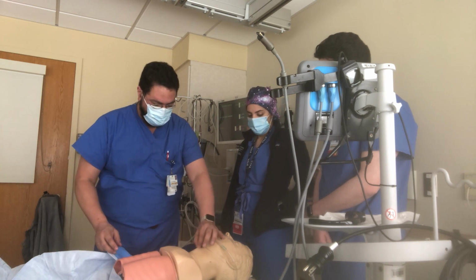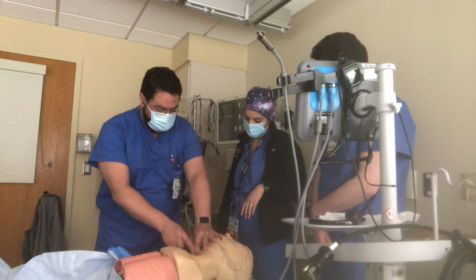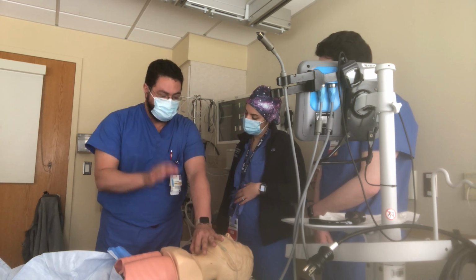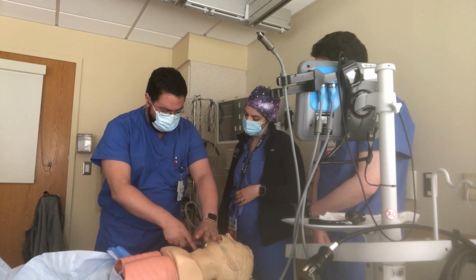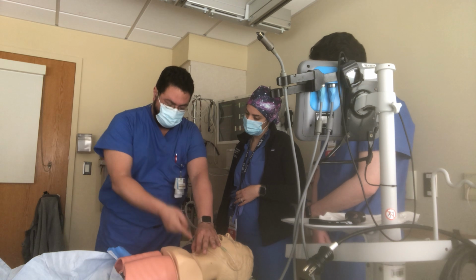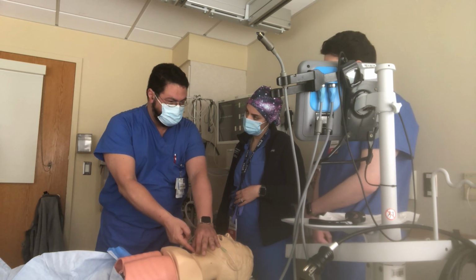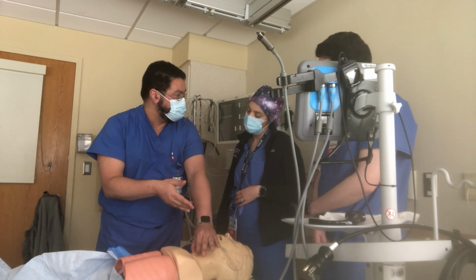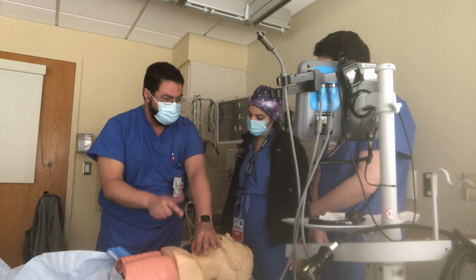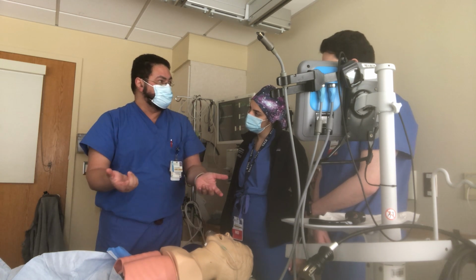So what I would do, I would just do like this. Put your finger there, spread them. Don't leave this anymore. This is like a death grip now. This serves 3 functions. Number 1 is protecting the venous plexuses that are here, so you don't cut them. And number 2, making the two close to each other, so when you cut with one move of the scalpel, half the scalpel in, you'll be cutting both skin and membrane together. And number 3, you'll never have a false passage, because they're so close to each other, and the tube is so big, it's not gonna go in between.